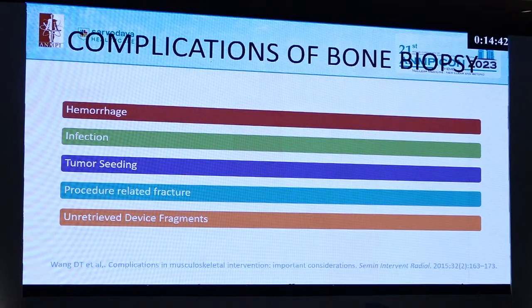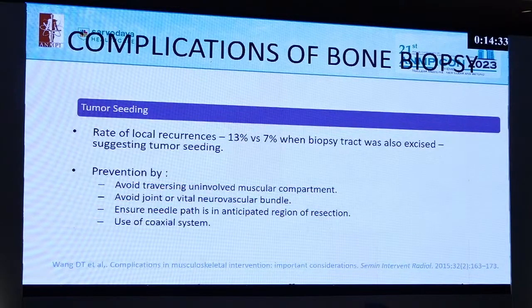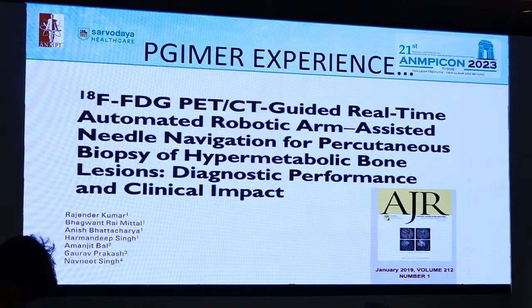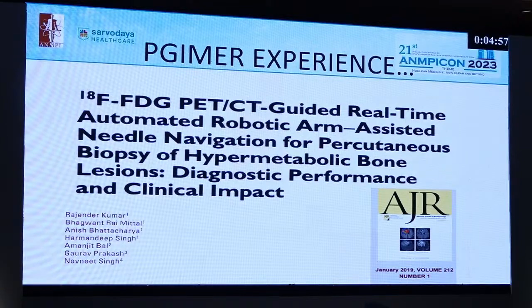Complications include hemorrhage, infection, tumor seeding, procedure-related fractures, and unretrieved device fragments. Commonly, we face tumor seeding. Tumor seeding is a common problem, so we have to ensure the needle path is within the anticipated region of the surgery. We have a very good publication from PGI Chandigarh about bone biopsy.